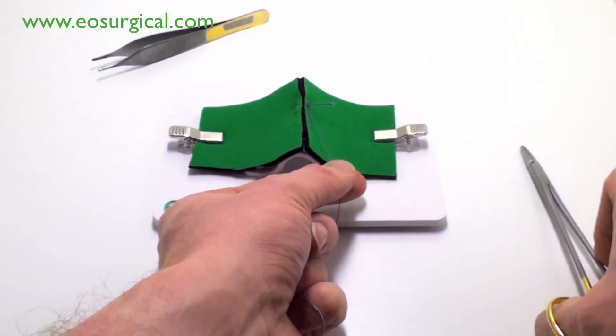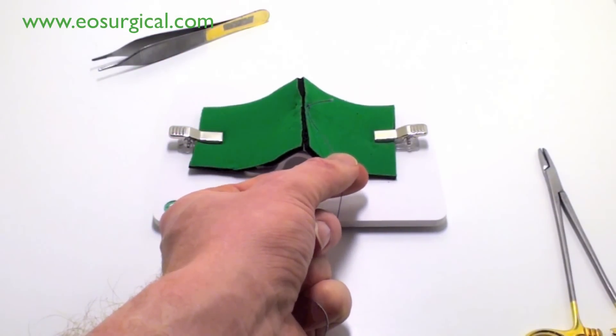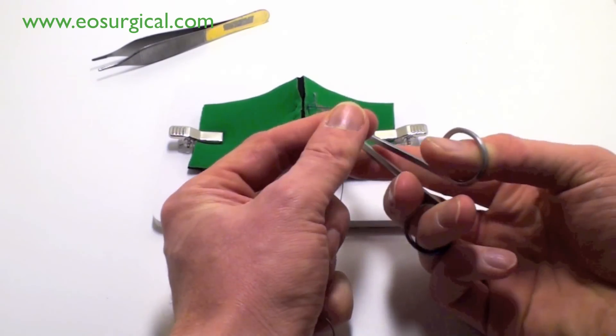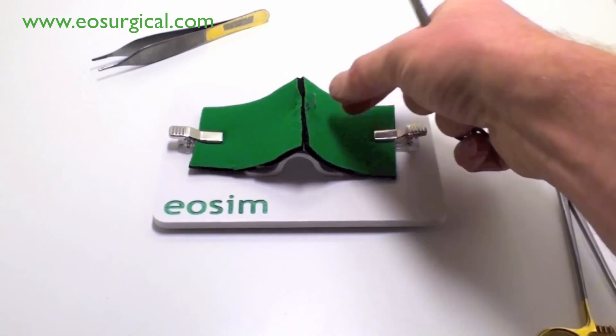Note that the hands are crossing over so that the knots lie square. So let's recap what we've looked at here.